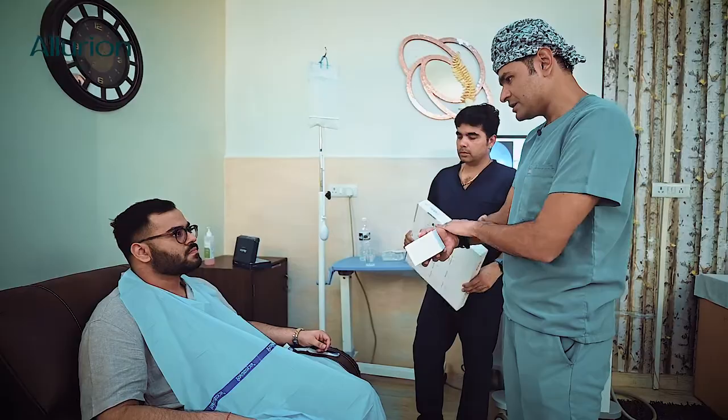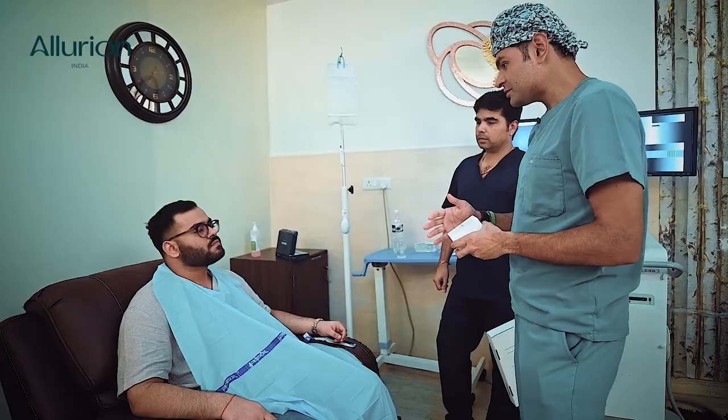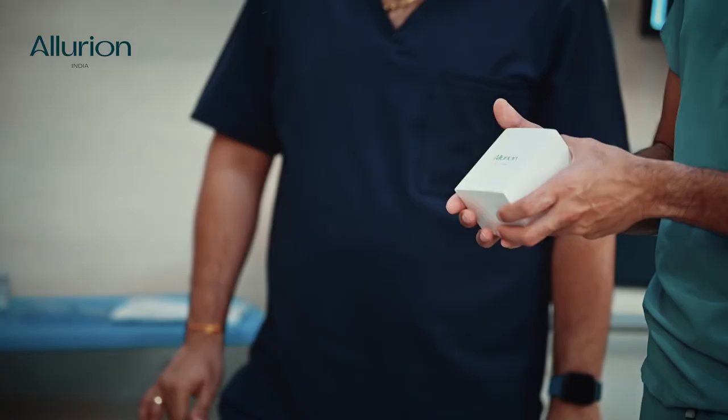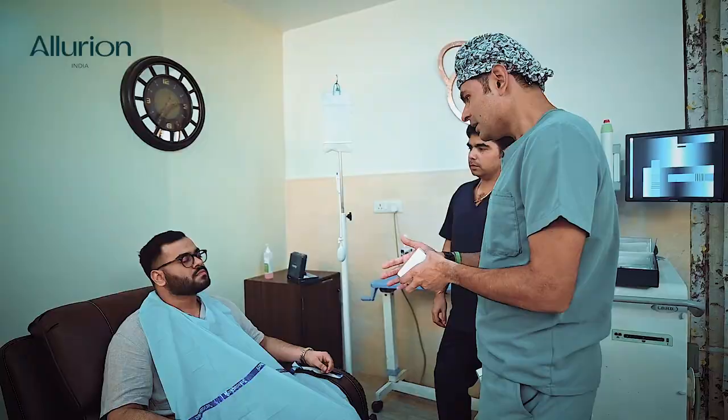Along with the scale, we'll also give you this health tracker, which can be worn on your wrist just like a watch. It is also very advanced — it provides information on the amount of calories you burn daily, your number of steps, calorie consumption, basal metabolic rate, and several other sophisticated parameters that let us monitor your growth and progress in terms of weight loss, increased activity, and fitness.